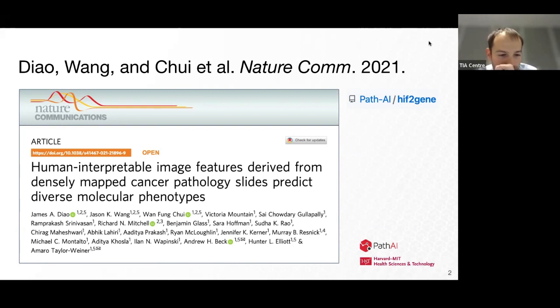I suppose one final question for me really is, one of the main benefits of these HIFs is that they are at the slide level and you've got 600 odd features that you can interpret quite nicely. I know you've already said that you potentially lose context by looking at them at the slide level. So did you think about tiling up the images and looking at tile level HIFs, for want of a better phrase?